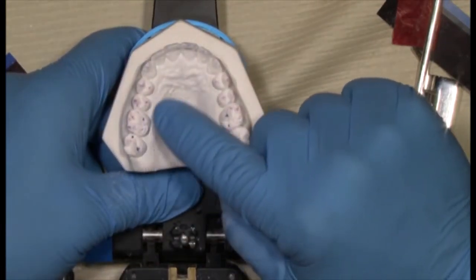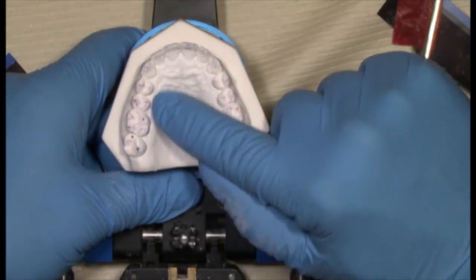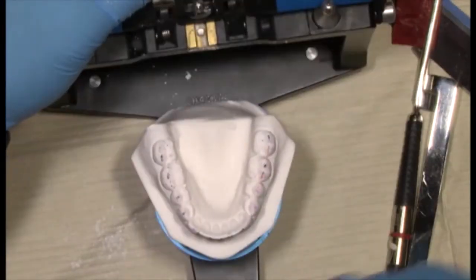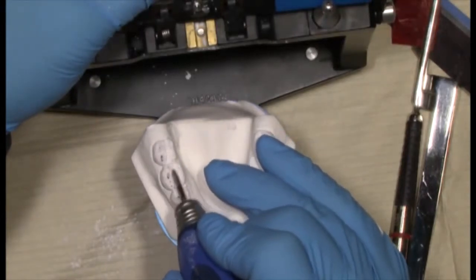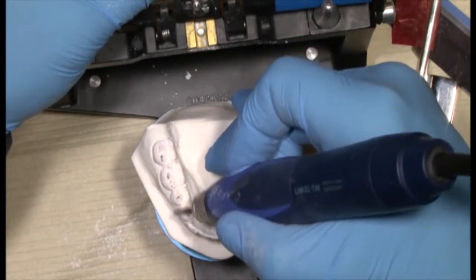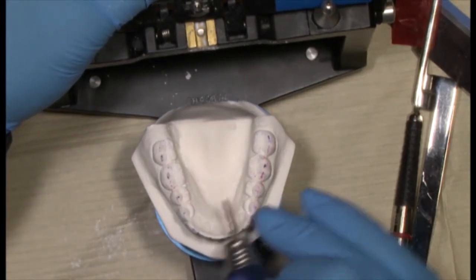Again, you can start to see all four of these teeth are now in contact, two of these teeth in contact. These are clearly on the cusp tips. All the upper lingual cusps would be left alone. We would continue to deepen the fossa, making sure it's only on the tip of the cusp, not any of the incline of the cusp. If there's any contact on the incline, when the patient touches and squeezes, it could shift the jaw to one side.